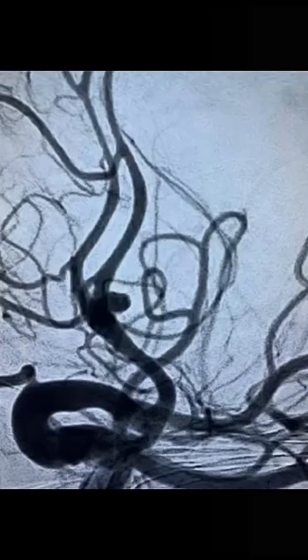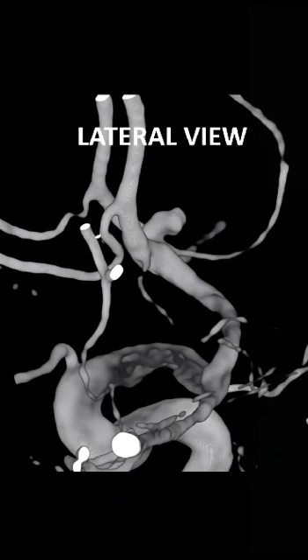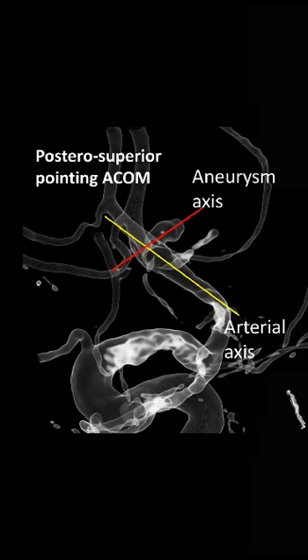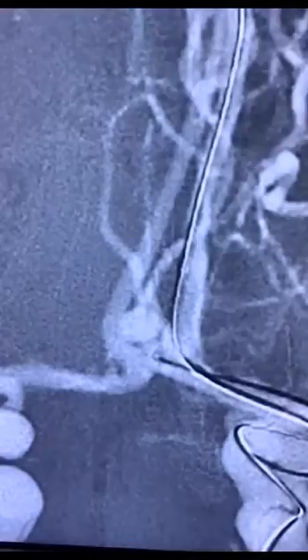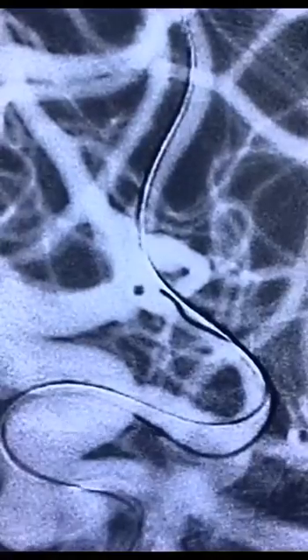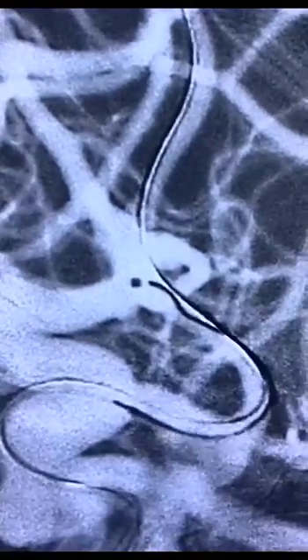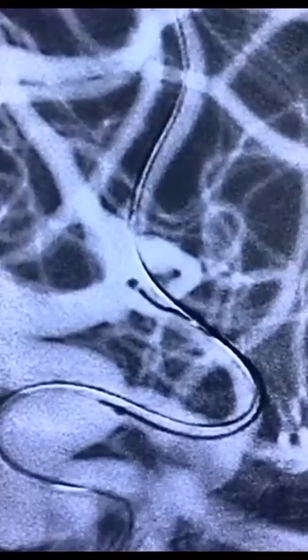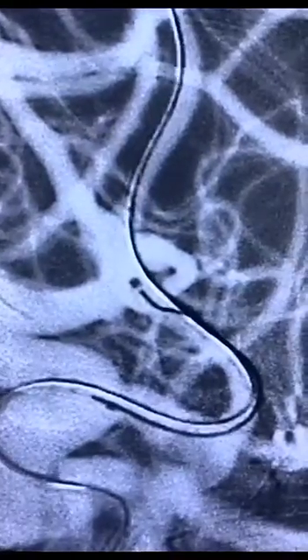It can be quite challenging to treat a posterosuperiorly pointing ACOM aneurysm, as is shown in the 3D angiography. The aneurysm axis is clearly opposite to the direction of the arterial axis. A reverse curved tipped microcatheter — here a Headway 17 — was used. The microcatheter was torqued in such a way that the tip would point towards the aneurysm sac.